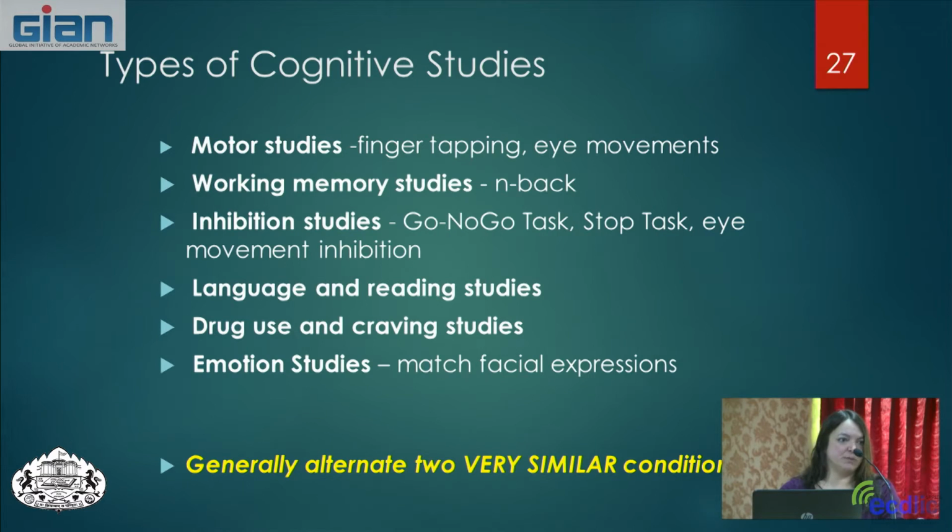So these are some types of working memory tasks that we have. We also have a spatial N-back task where we show the person blocks in locations, and we say, if this location occurred 1 time ago, you press this button. If it occurred 2 times ago, press this button. So we can get pretty complicated working memory studies with this.